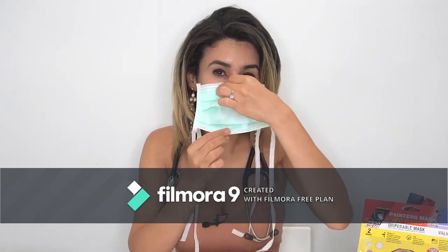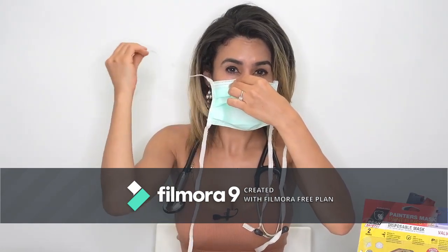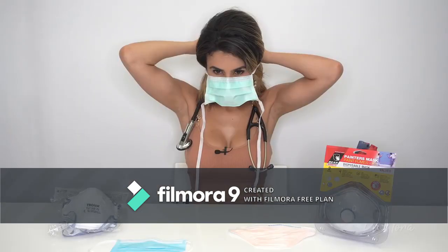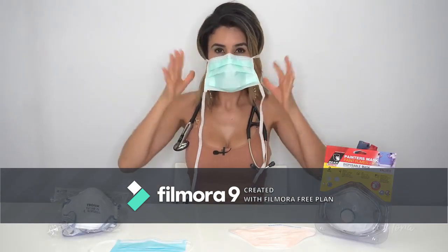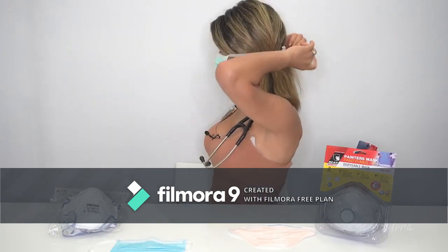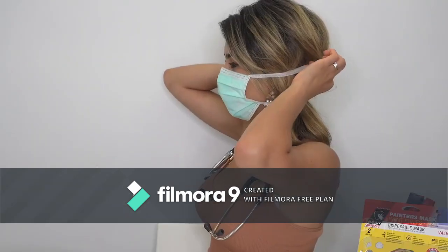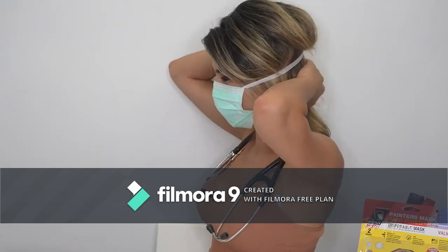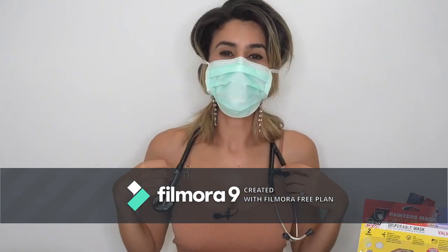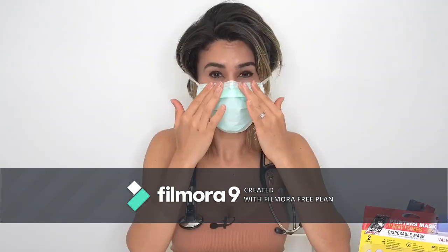Following this, pull down the mask on the bottom, then tie the two sides around the back, and do the same for the bottom as well. Try to ensure that the top tie is above your ears and the bottom tie is below your ears — this will help give you a nice tight fit. Once you've tied the ribbons, press again on your face to ensure there's a tight seal.